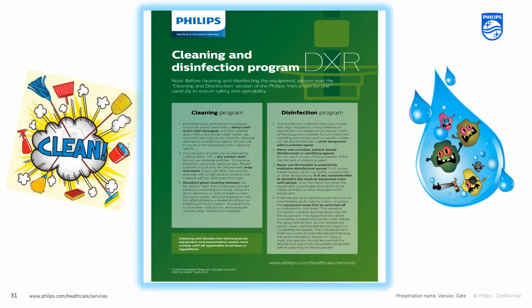This is our reference for our cleaning and disinfecting program from Philips. It is available to download at philips.com/healthcare/services.